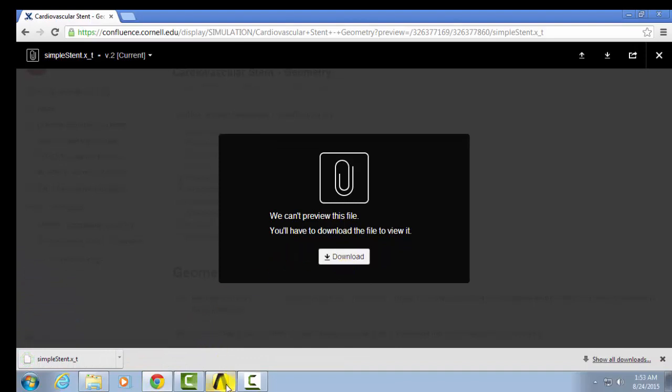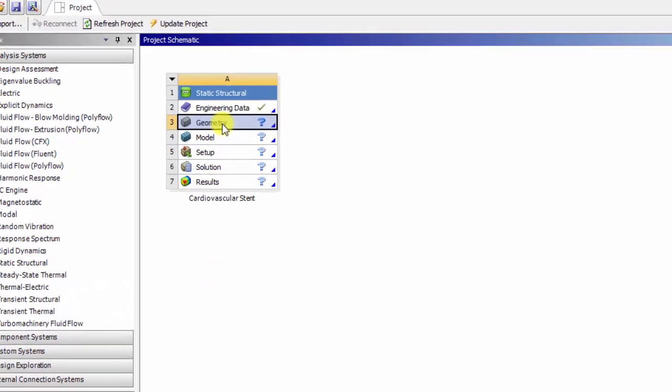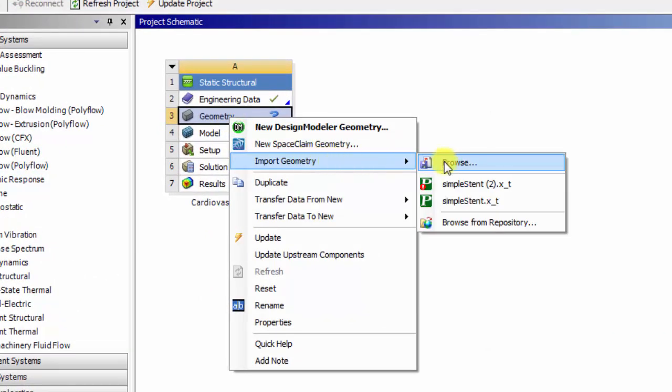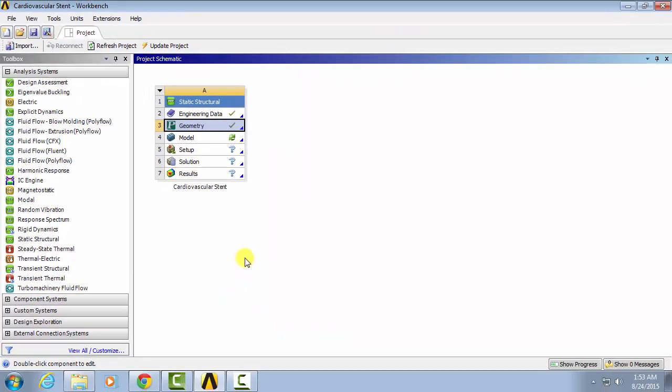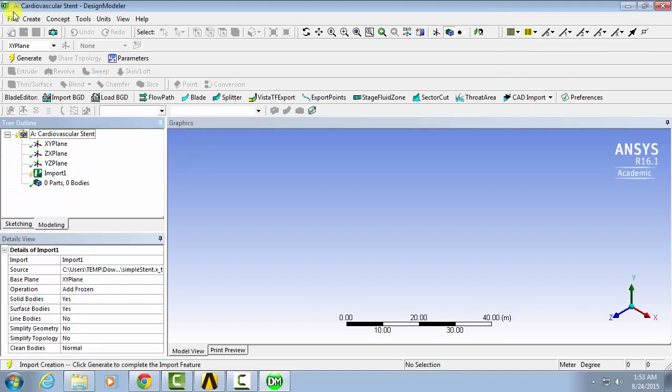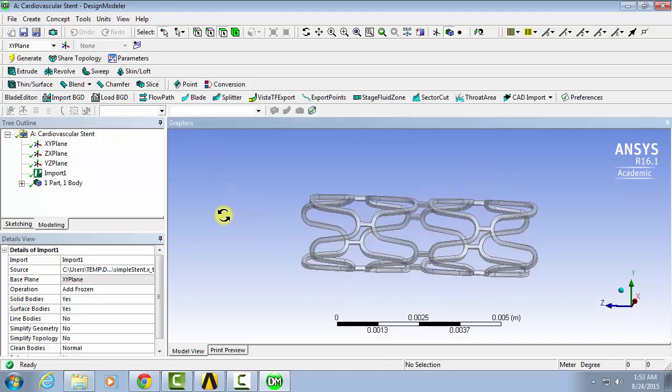Once you do that, you can then import that Parasolid file into the model by right-clicking on Geometry, Import Geometry, Browse, and then selecting the simple stent and opening it up. Then you can double-click on Geometry to open up Design Modeler, where we can do some edits to the geometry. And click Generate. So you can see we have a very simple 3D model of a stent.